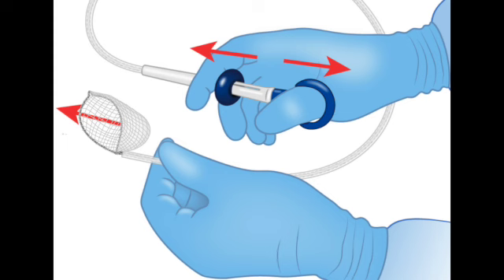It gives you that perfect sharp point for precision. You gently nudge the polyp out of the trap chamber and carefully place it into the formalin jar for preservation. Wow. A toothpick. I love that. Simple, cheap item, but used with surgical precision in this incredibly high-tech environment. Human ingenuity right there.